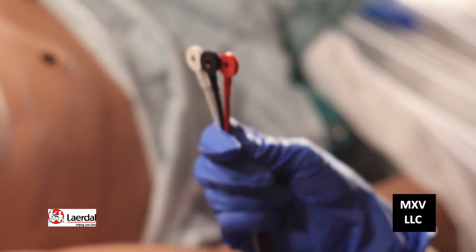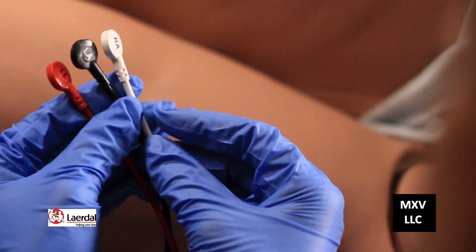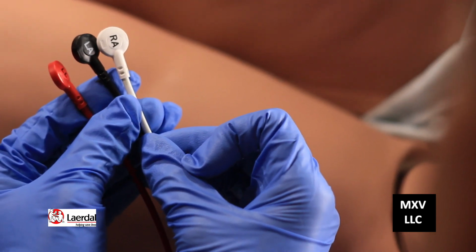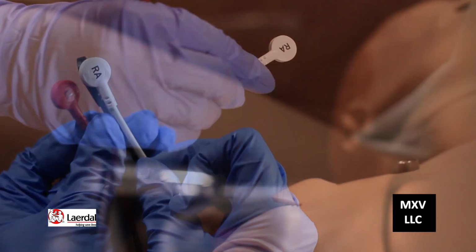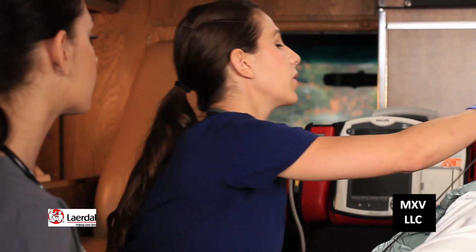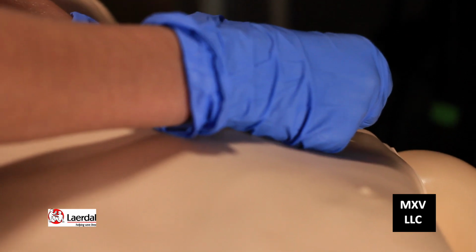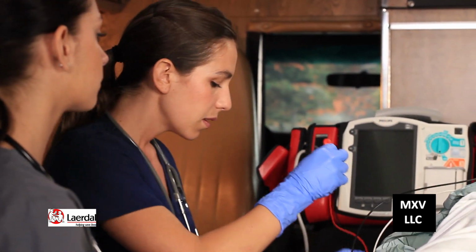All right, for a 3-lead EKG, I'm going to show you how to put the leads on. We have 3 leads, red, white, and black, and they're all labeled. We have the one that says RA for the right arm, and we're going to put that below the patient's right clavicle. LA for left arm, below the left clavicle. And LL for left leg, to the left of the patient's umbilicus.